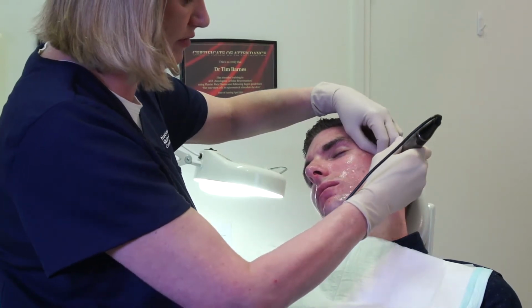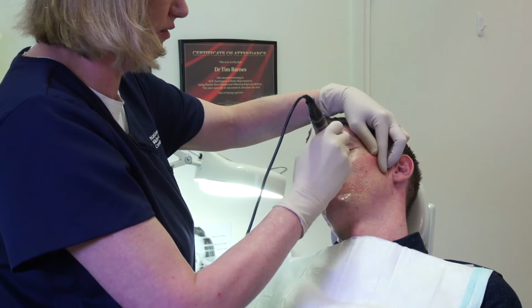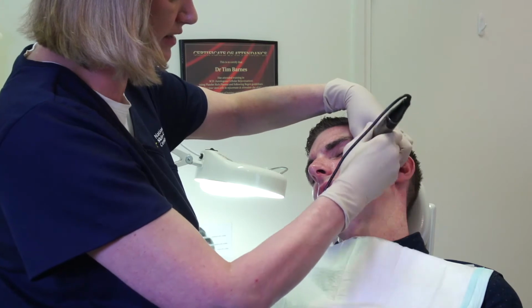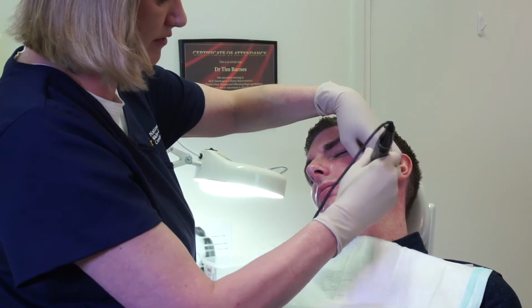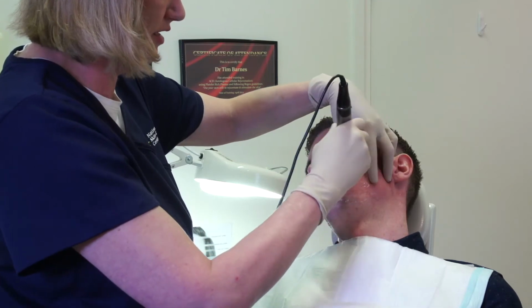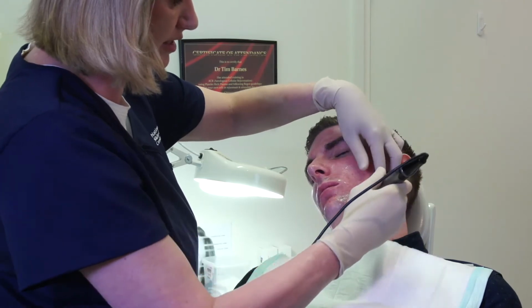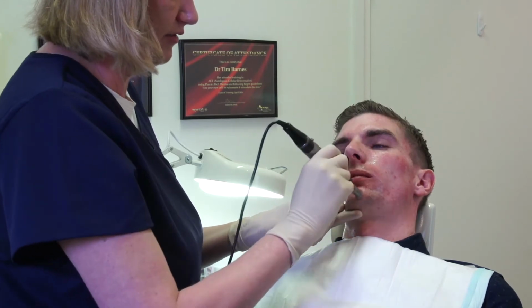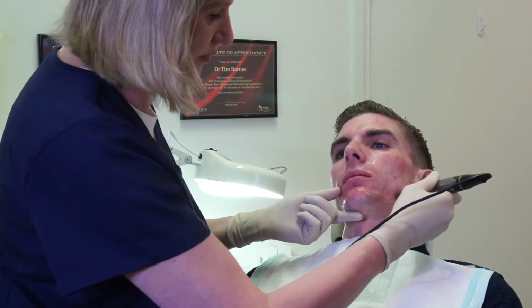So most of our patients with Dermapen, we advise them to come back for some repeat photos after 3 to 4 weeks to see what the effects are and decide whether they need another treatment. If you've got significant acne scarring, it's probably advisable that you have a series of up to 3 treatments about 3 to 4 weeks apart. Minor scarring, a lot of patients are happy with just 1 treatment. But you've really got to warn the patient that there's a period of skin reconditioning that goes on, improvement in the collagen over a period of time, so you've got to be a bit patient with it and give it that 3 to 4 weeks before you assess the need for a further treatment.